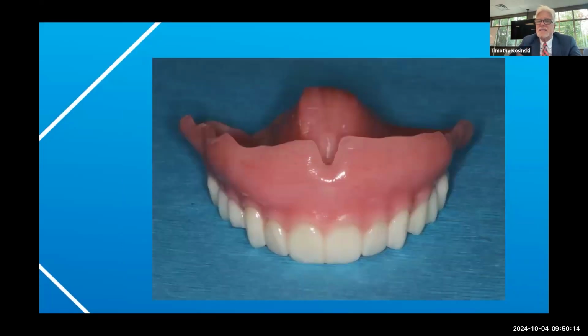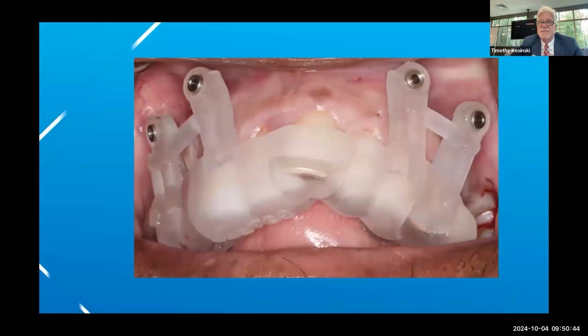Now, in my cases, my all-on cases, I always have a denture in place, just in case. And this is just a digital denture, because you have to get initial torque with your implants to be able to load them immediately. So I have no problems, as long as you communicate ahead of time, not loading my cases immediately, but rather allowing those implants to heal unimpeded for a short period of time. It's the end result that matters.